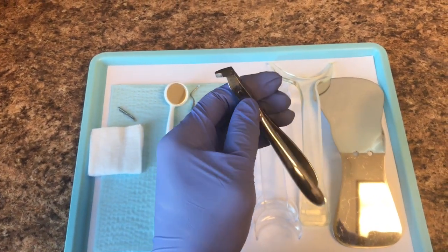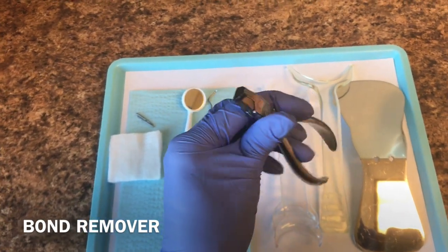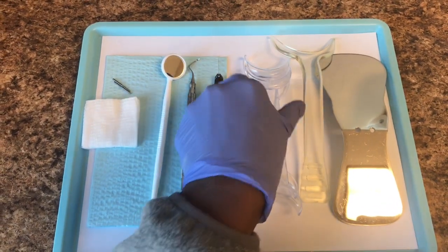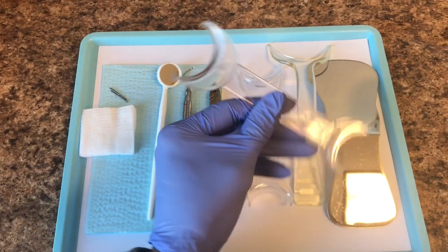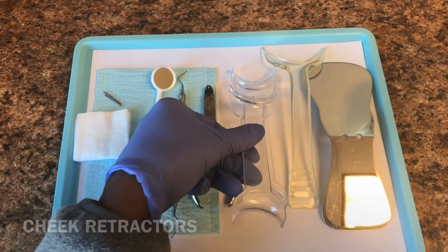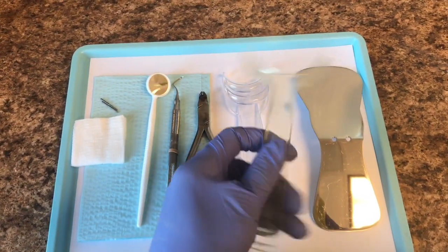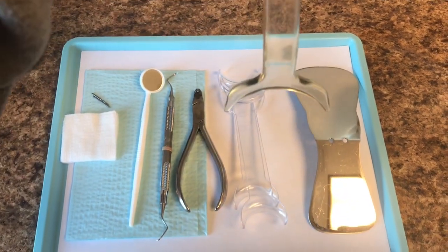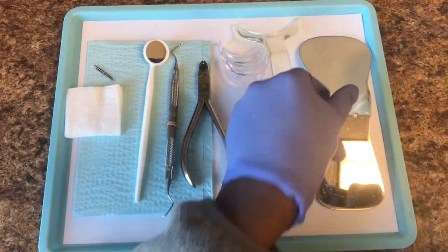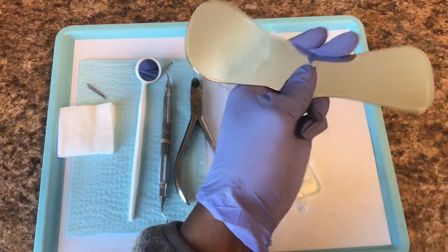We have here a bond remover, which removes the brackets — they come off pretty easily with this plier. Here we have two cheek retractors, which are used to keep the cheeks away when we take our final photos. We also have another cheek retractor here for the upper and the lower lip. Also have this mouth mirror here used to get pictures as well.